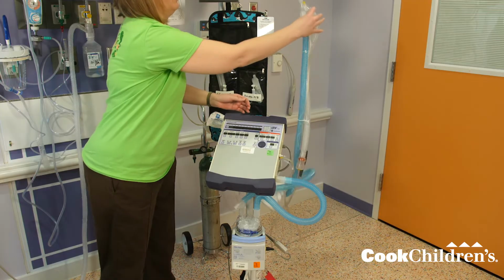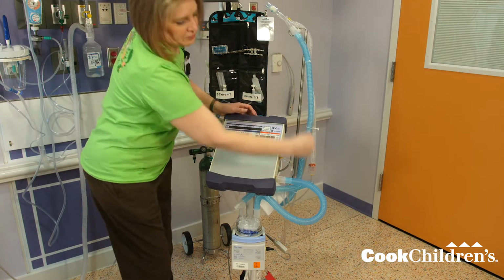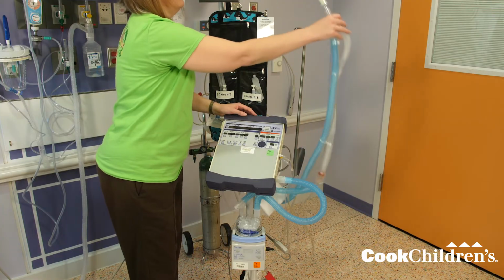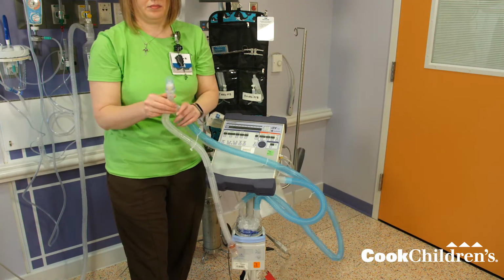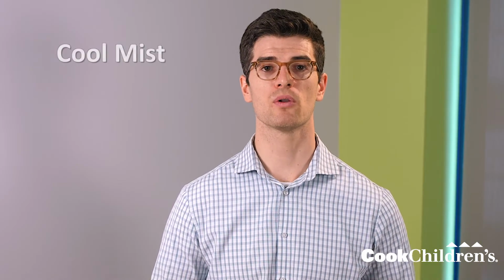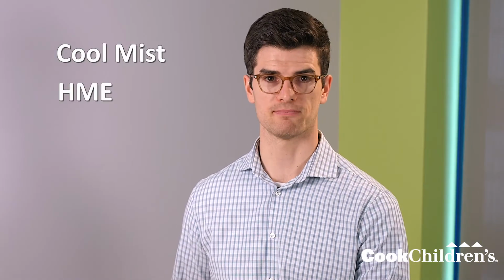The heater is attached to the ventilator tubing. If the heater is not in use, the inline HME is attached between the trach tube and the ventilator tubing. For children with a trach who are not on the ventilator, there are 2 different ways to provide humidification. The 2 ways are cool mist or HME.